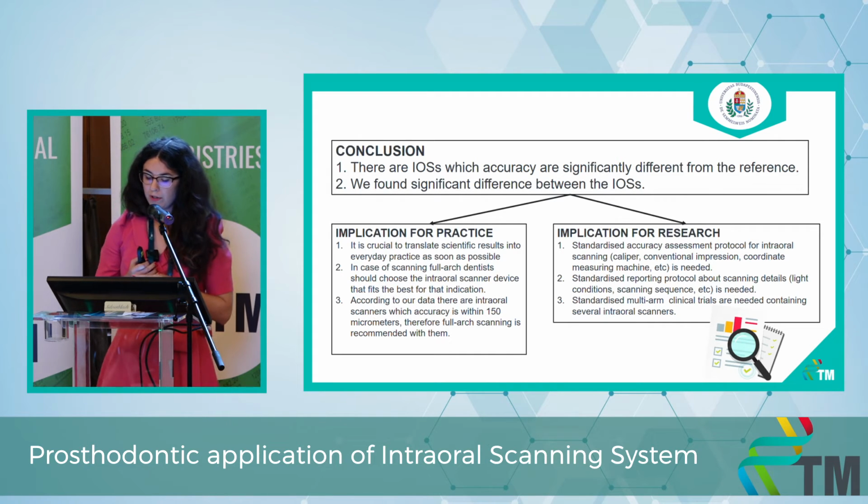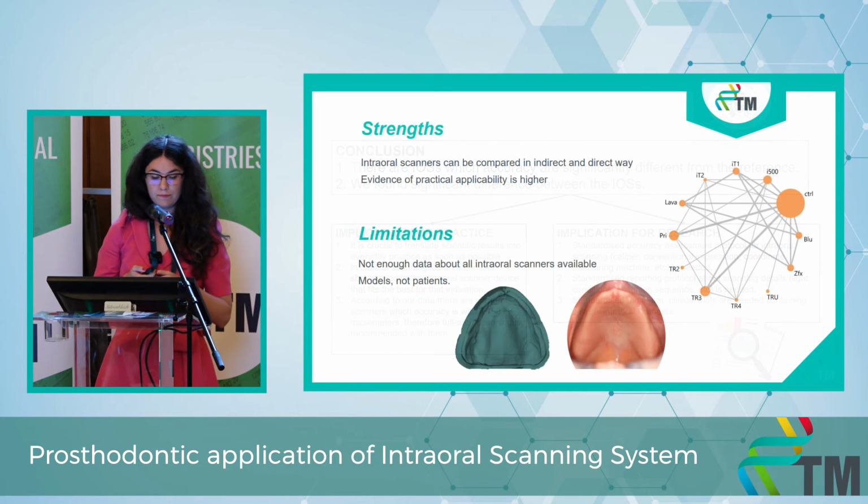And also as for implication for research, we need a standardized accuracy assessment protocol for the intraoral scanners because in the literature they use many kinds of protocols and we need to make it standardized.